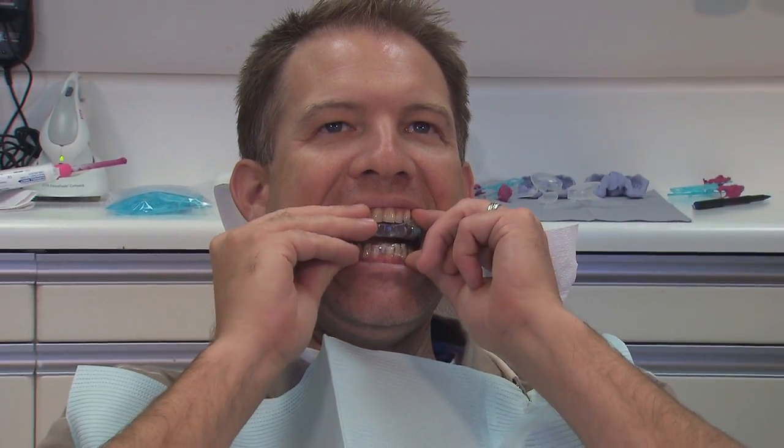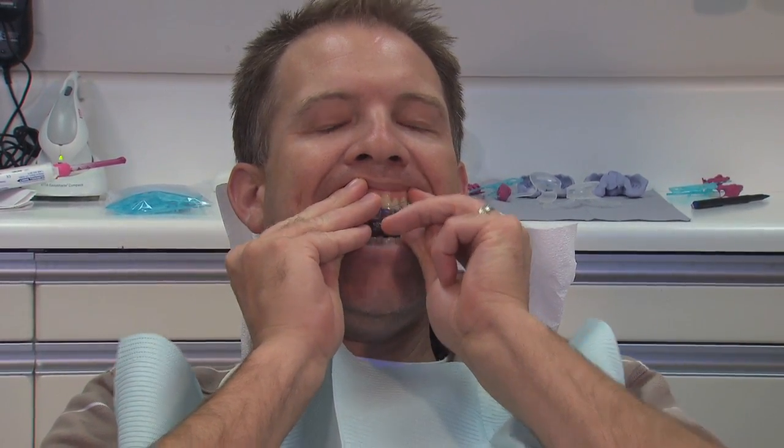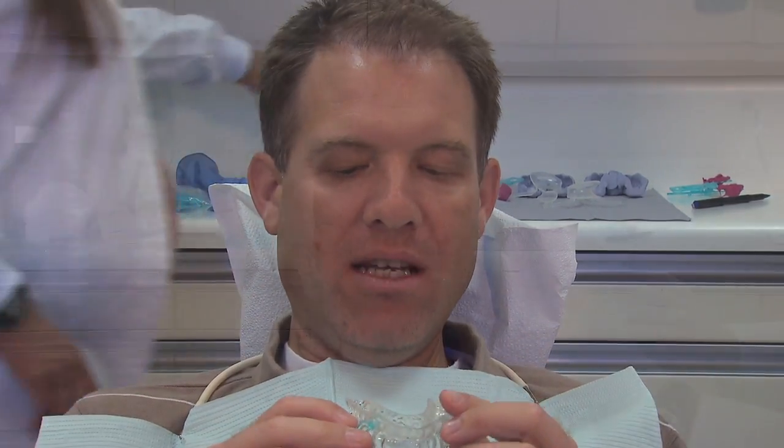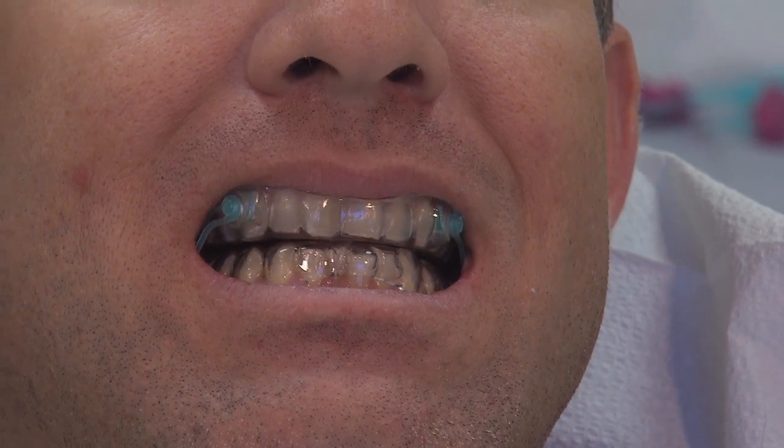You can see it takes a little bit of work for him to snap it off the lower there, but he'll get used to it. And then again, I'll hold the mirror for them and have him put it into place while he watches so he can see. And we just want to make sure that when they leave the office, they have a good understanding of how to put it in, how to take it out. I'm sure they'll figure it out at home as well.